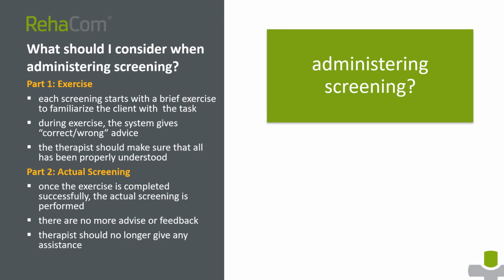During the exercise, the system gives correct or wrong advice. The therapist's task is to make sure all has been properly understood. Once the exercise is completed successfully, the actual screening is performed. There is no more advice or feedback. The therapist should no longer give any assistance.